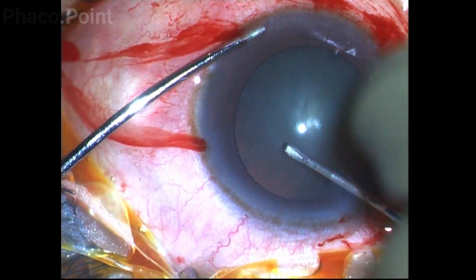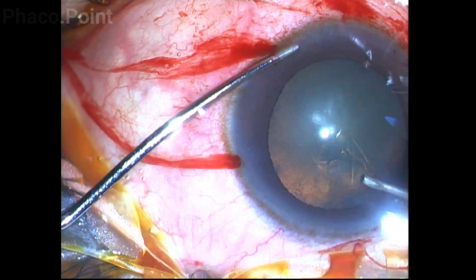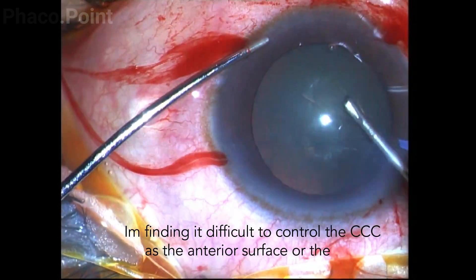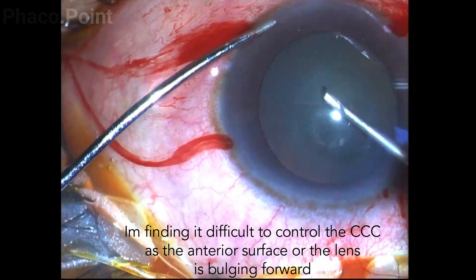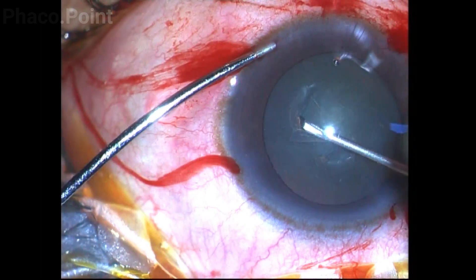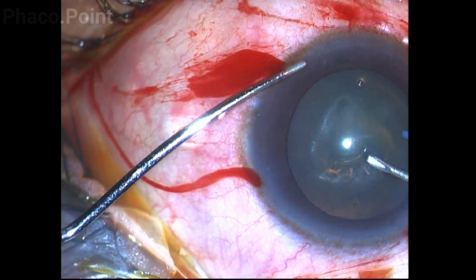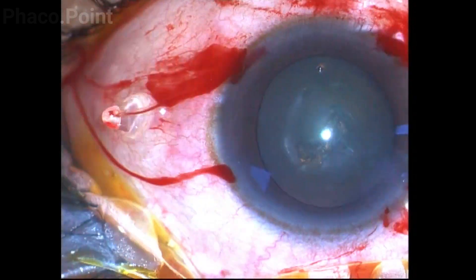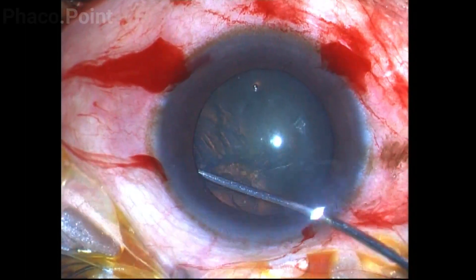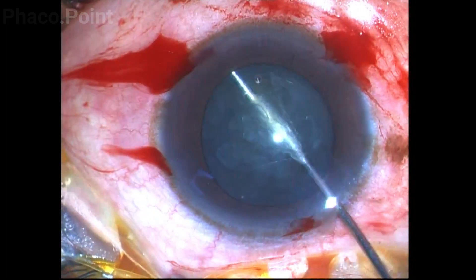We start off with the creation of a continuous curvilinear capsulorexis, with the ideal size to aim for being around 5 to 5.5 millimeters. In this patient I'm finding it difficult to control the rhexis because the anterior surface of the lens is bulging. A careful cortical cleavage hydrodissection is performed, the completion of which is checked by noting the ability to rock the lens.